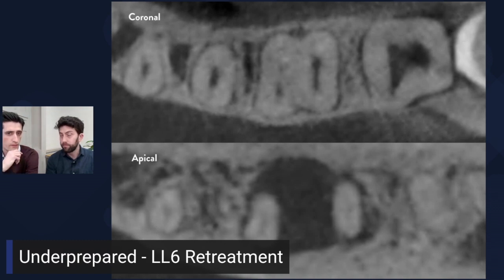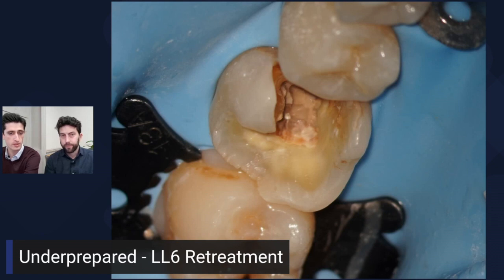Looking at the coronal slices, CBCTs give you a roadmap going forward. Particularly with mesial roots on lower molars, they often have that flat morphology, so I'm looking at utilizing an instrumentation system that's going to be a bit more delicate in that preparation. I'm not a big fan of stripping teeth out. I want a system with the ability to create some apical form and shape so I can confidently exchange irrigant — something that prepares apically but preserves coronally.